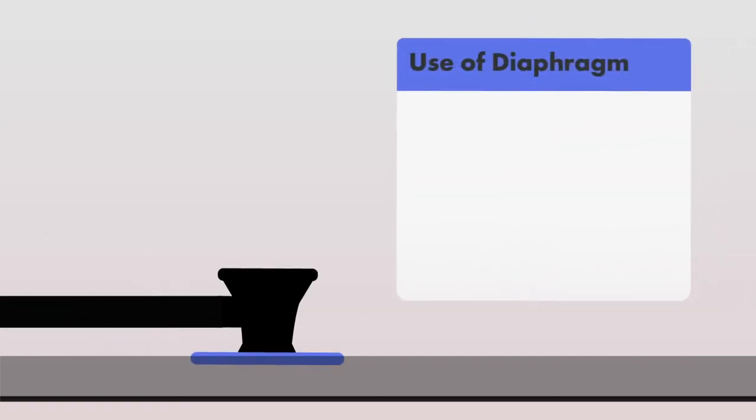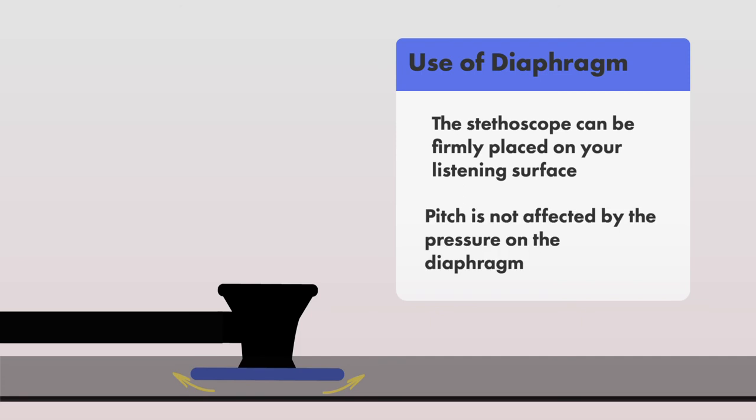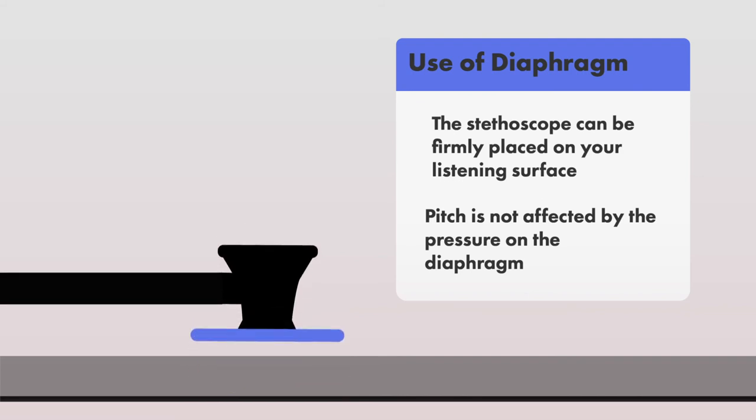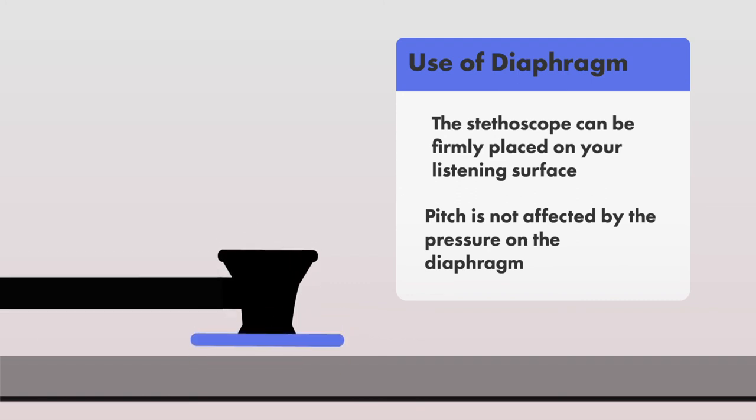This is in contrast to listening with the diaphragm, where the stethoscope can be firmly placed on the person's chest when listening. Additionally, the pressure to which you are placing the diaphragm on the patient's chest should have little to no effect on the pitch of a heart sound. In fact, the distance the stethoscope is from the chest can be used to grade an intensity of a murmur, which we'll talk about later in another video.